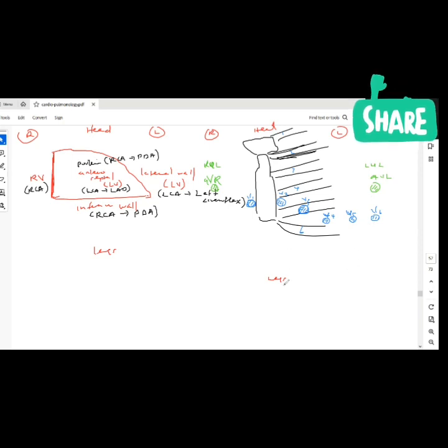And then on the legs, you have your right lower leg here, left lower leg there. Then we have another lead only on the left lower leg, not on the right. We call that AVF, F for foot. So AVL, AVR, AVF, right? So we are still missing how many leads? We're missing 3 because this is a 12 lead ECG. We have 9, but we're missing 3.